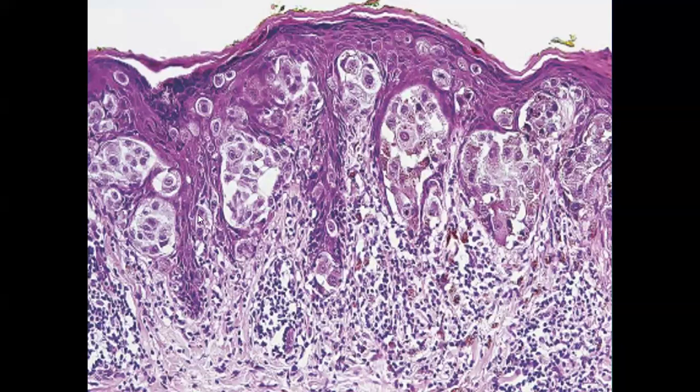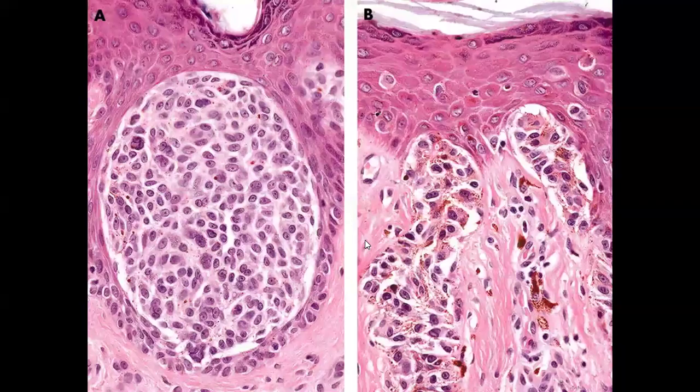So the first impression of this picture is a complete irregularity or disarray. Usually the tumors are picked up by this feature alone, that the picture would look like a complete disarray or disorganization.